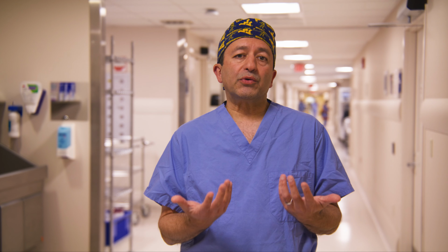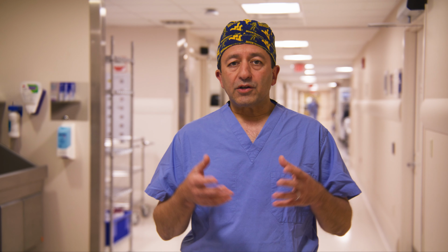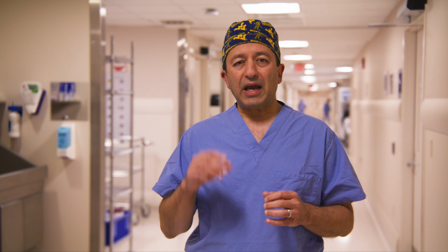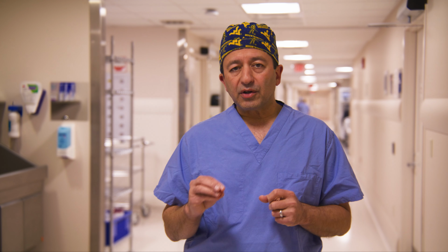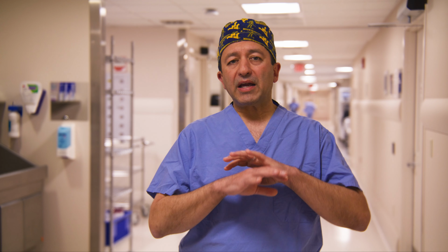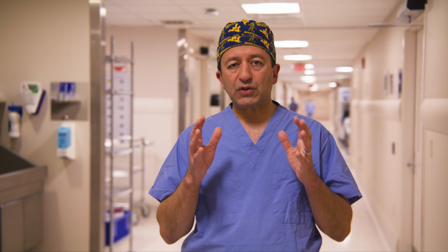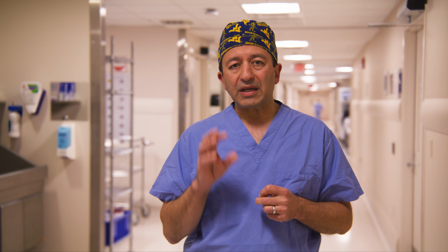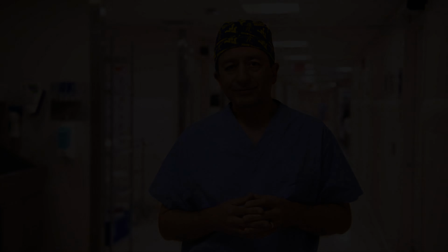Those patients may not actually be a good candidate for transcatheter therapy. Sternotomy aortic valve replacement may also not be ideal. So join us in this episode where we're going to start to approach much more complex calcific pathology and how, with precision, we can mitigate the chance of stroke by very detailed and precise visualization and aspiration at the time of performing a seamless RAVR.